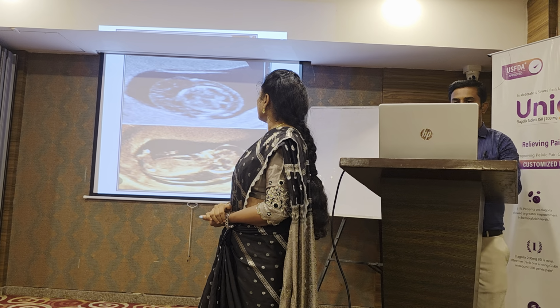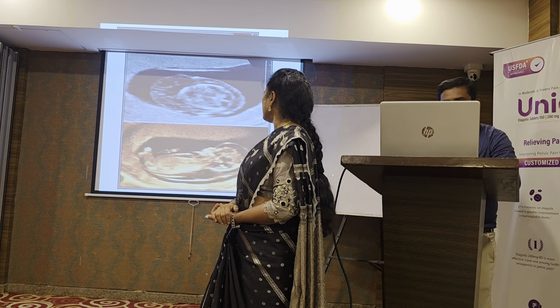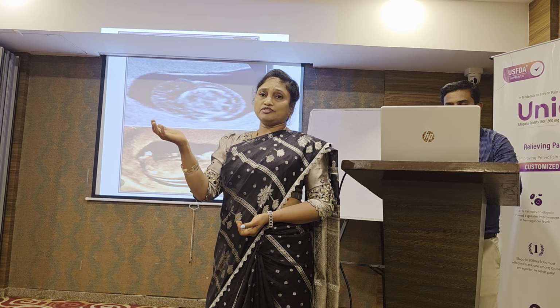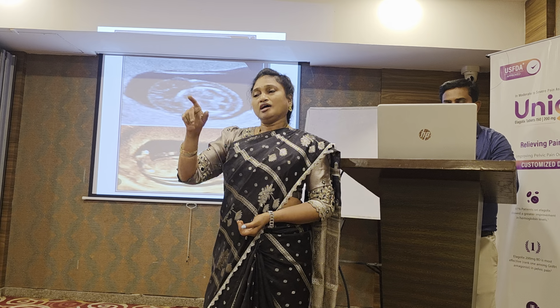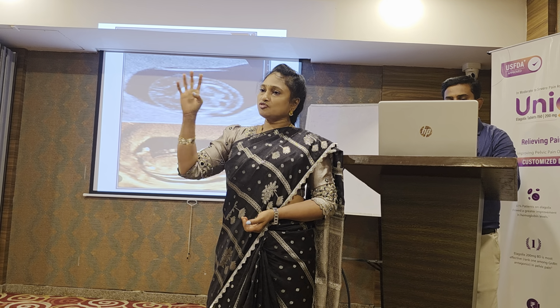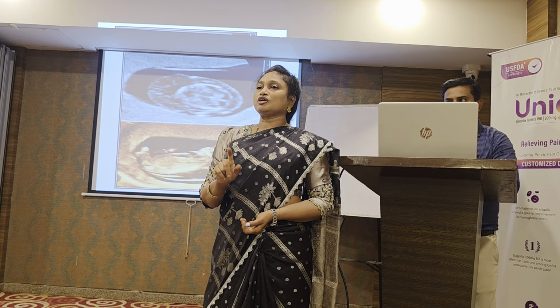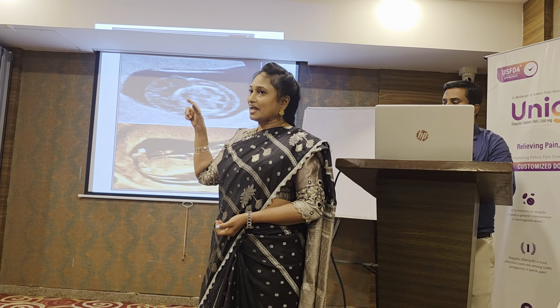So all these are typical clear-cut cases. Only the borderline cases, usually they decrease in the next 15 days. When you check, it will come down. If at all the patient comes in the 4th or 5th month, it will not be there at all. It doesn't mean that the baby doesn't have Down's. It is just that that is the right time to pick up.